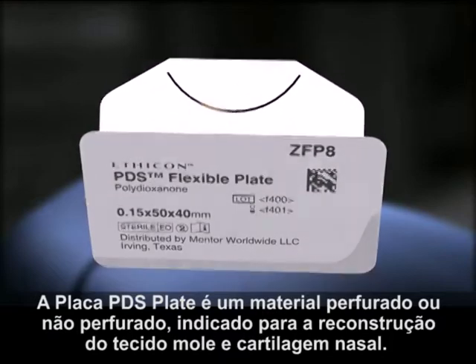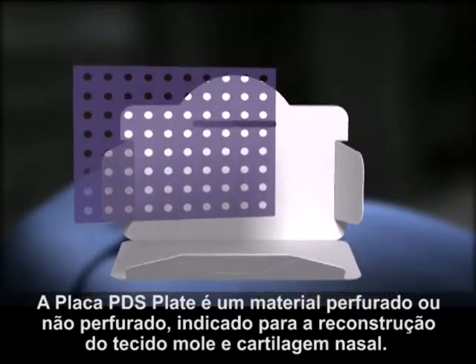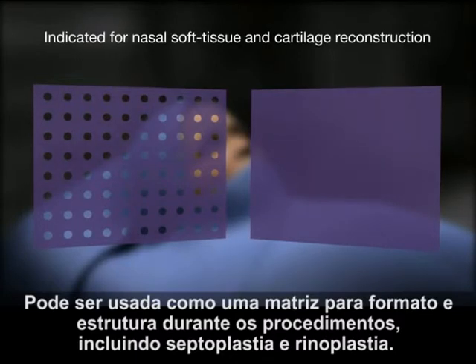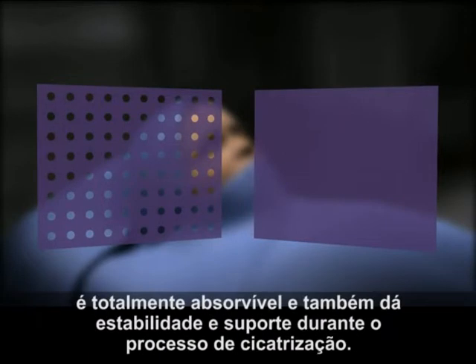PDS Flexible Plate is a perforated or non-perforated material indicated for nasal soft tissue and cartilage reconstruction. It can be used as a shaping and structural aid during procedures including septoplasty and rhinoplasty. Made from the same polydioxanone compound as Ethicon's PDS Suture, it is fully absorbable yet provides stability and support during the healing process.